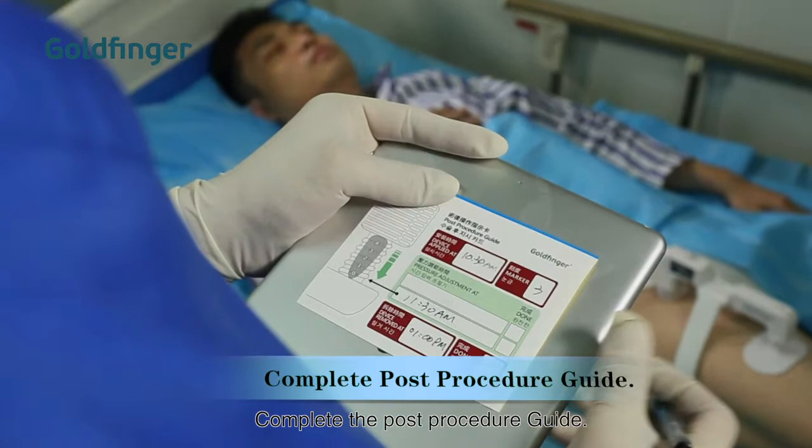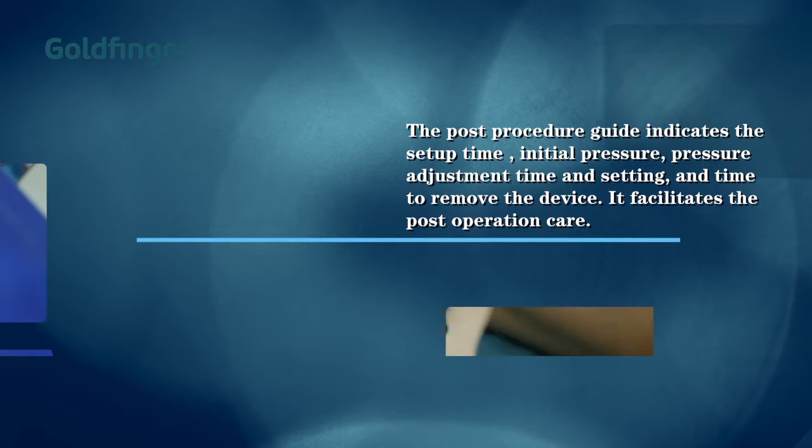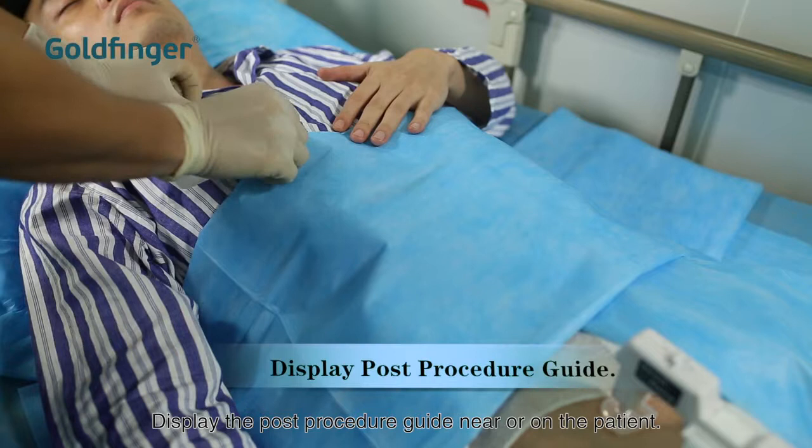Complete the post-procedure guide. The post-procedure guide indicates the setup time, initial pressure, pressure adjustment time and setting, and time to remove the device. It facilitates the post-operation care. Display the post-procedure guide near or on the patient.